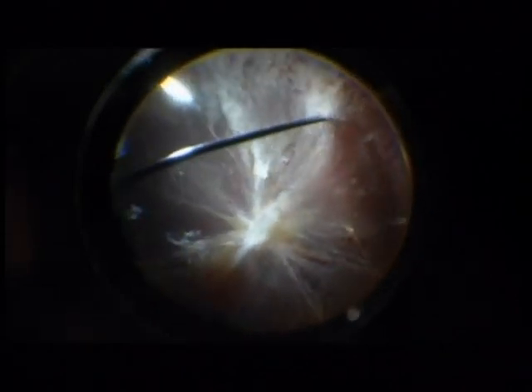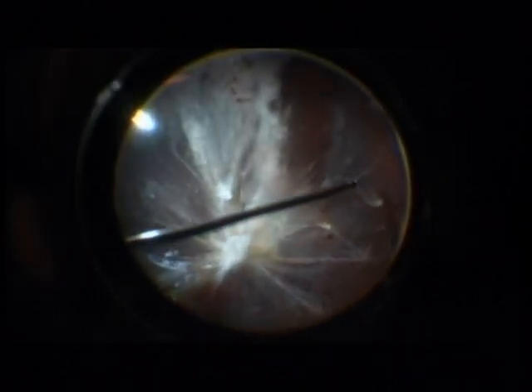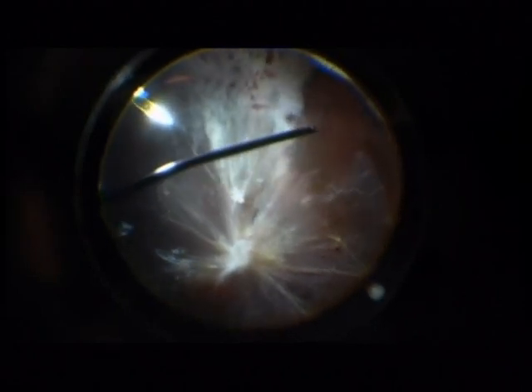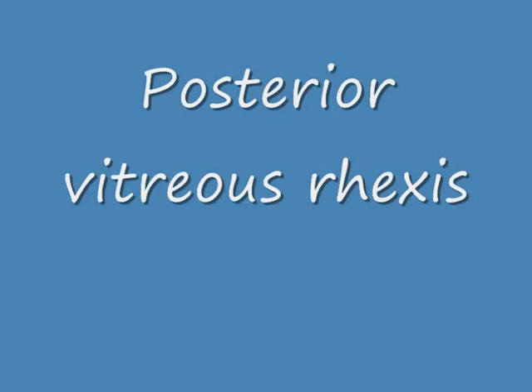Now you see I am opening the posterior hyaloid. I am using a 27 gauge vitreous cutter. Here you see the opening with the blood staining. Now I am working with a scleral depressor. Always be careful in those places where you don't see the retina, because you may injure the retina and cause a big break.